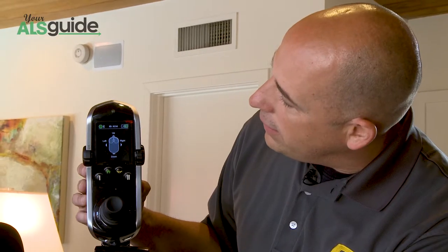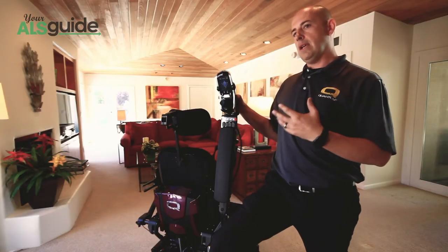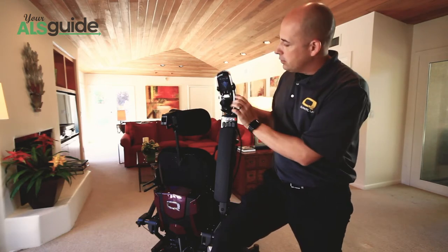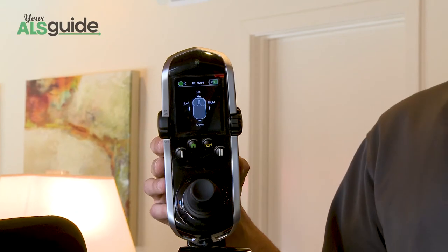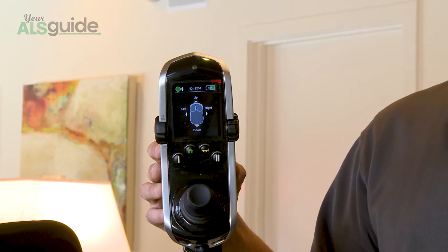Additionally, this will control the cursor in mouse mode. And you can use a variety of different ways to click. So you could do like a double left, and it will put it into a clicking mode just through utilizing the joystick. Now keep in mind, this can also be done with switches from a head array, micro joystick, foot control. This same setup will work depending on what drive control that you use.